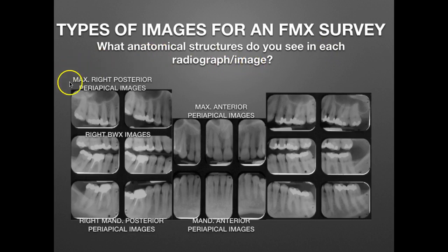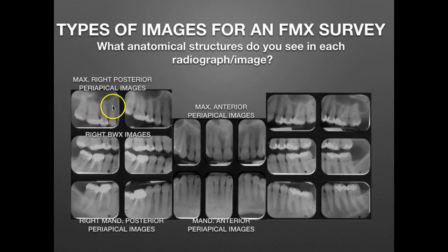First, on the patient's maxillary right posterior area, we have periapical images of the molars and the premolars. "Peri" meaning around, "apical" at the tip of the root — a periapical image allows the dentist to see the whole tooth from the crown to the apex and the surrounding area. This is very helpful in diagnosing periodontal disease, endodontic conditions, tumors, and impactions. The anatomical structures visible include the crown, the root, the apex, the enamel, dentin, pulp chambers, and pulpal canals.